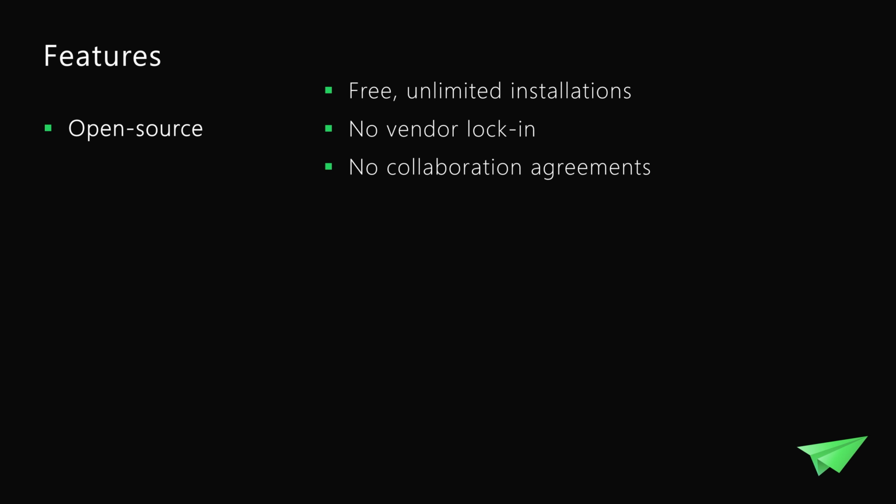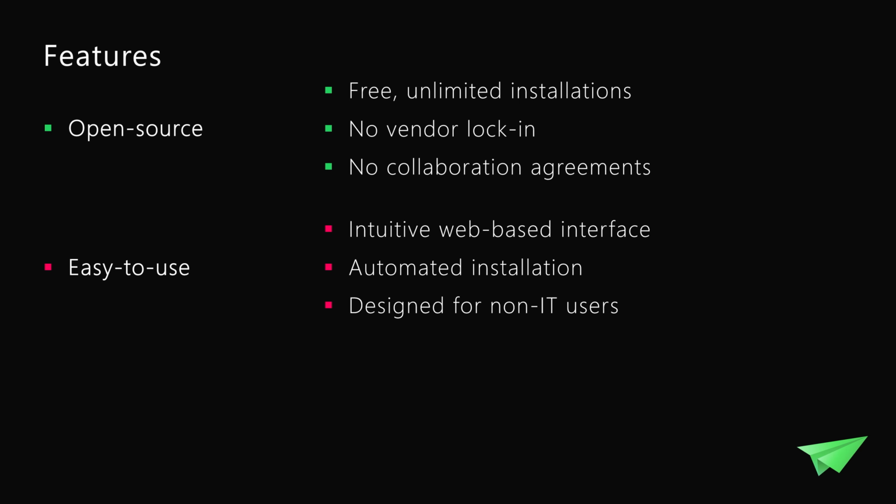And it also makes it very easy to collaborate with other sites, because if no commercial vendor is involved, your collaborators don't need to make any agreements with that vendor. They can simply download Mercure and install your algorithm. Then it's very easy to use. It has an intuitive web-based interface.